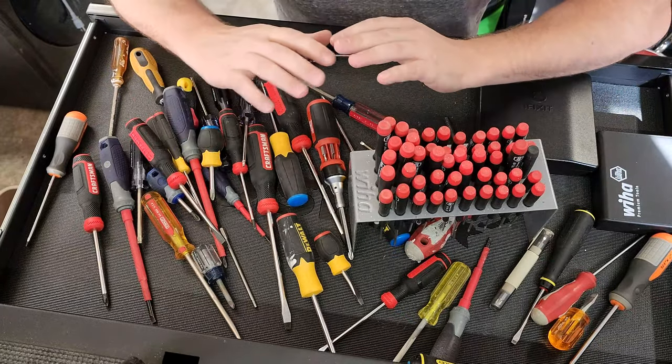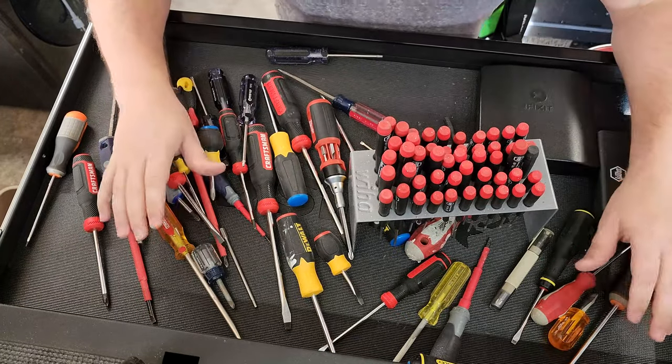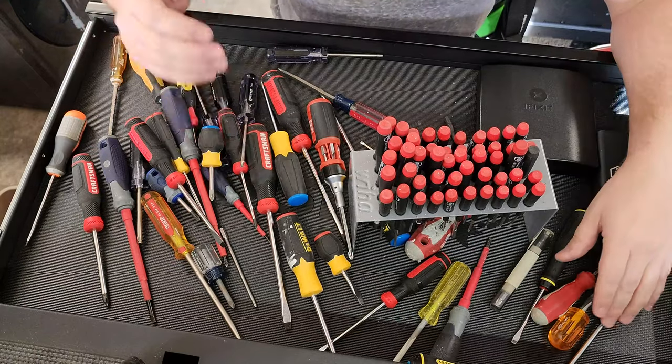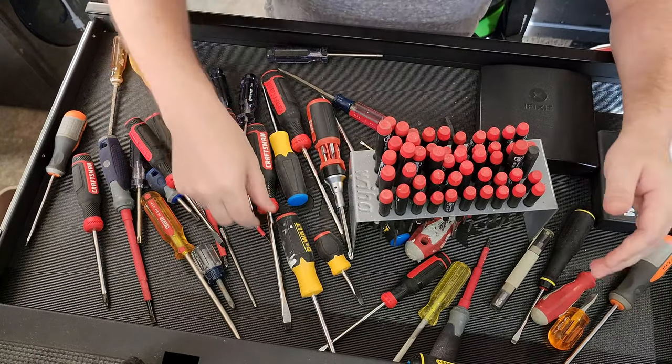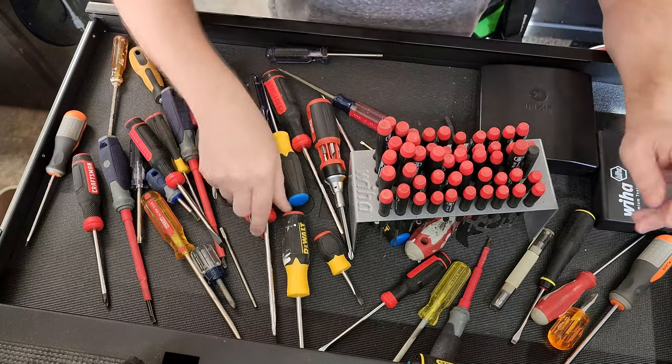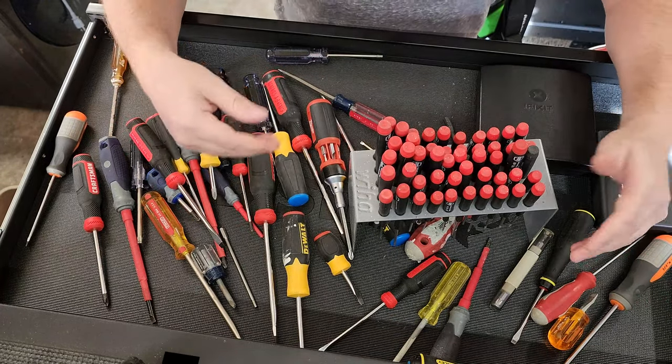Anyway, I know that's a long-winded rant about screwdrivers, but trust me, these are the basis for any Biomed's tool kit. You should get to know them and use them. Even though people will tell you 'don't use them as a pry tool' — yeah, right. We all use them like that. It is what it is.